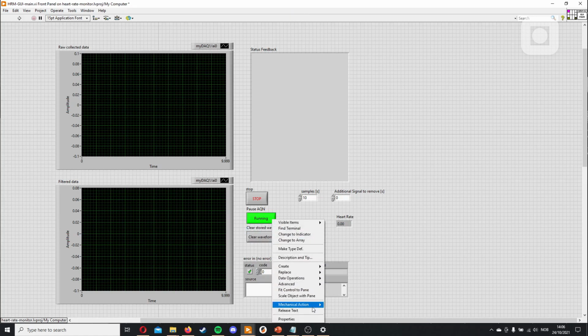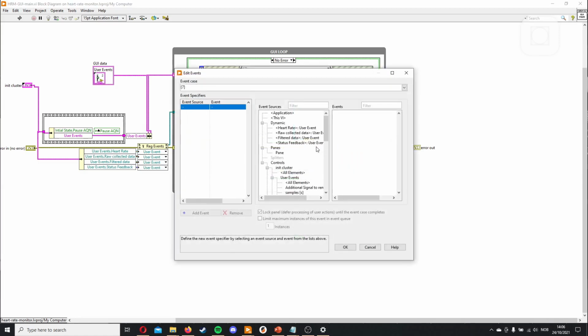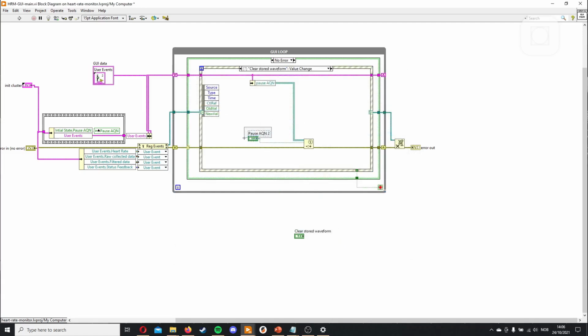And this one, we want it to be the mechanical action, because there's no on and off, it's just a signal to say clear waveform. We wouldn't even need to put it into the user event. But let's duplicate this event. Clear stored waveform, and delete the duplicate here.